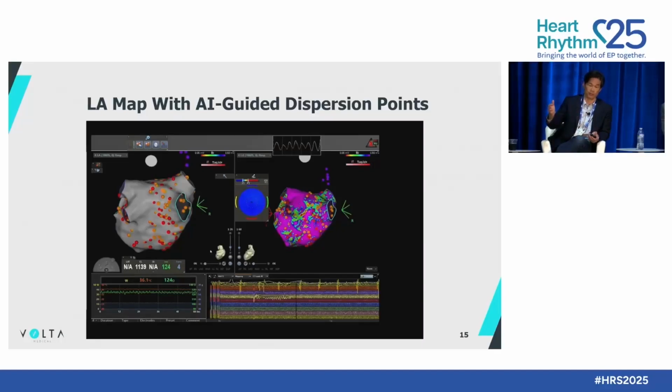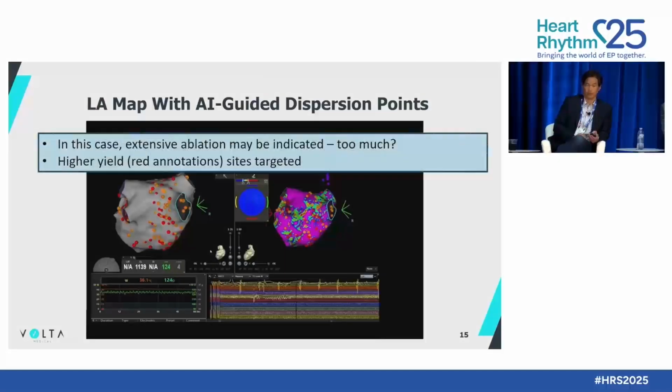Obviously you're going to do pulmonary vein isolation, or maybe not obviously, but I would. Then I start looking at the clustering, and I say, there's a lot in that posterior wall, a smattering along the ridge, and a smattering in the anterior left atrium. So maybe I'll take this one and do PVI and posterior wall isolation. And that's what we did with this one.